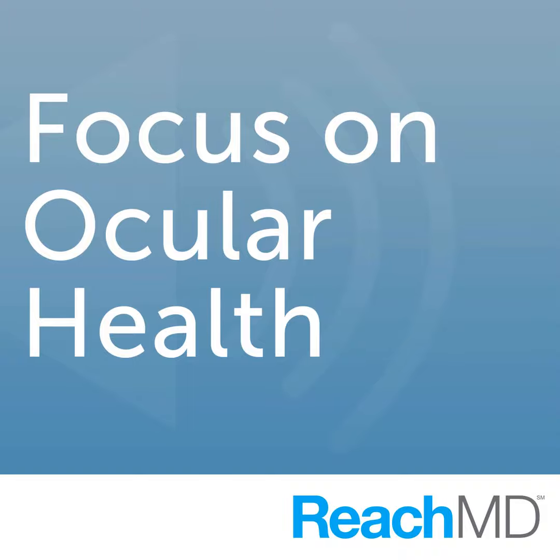It's non-invasive in the sense that we don't have to inject any kind of dye. It's very similar to ultrasound in that it's basically a reflection. Instead of reflecting sound, it's reflecting light waves. And the kinds of things that we can see are traction on the retina, which produces swelling. We can see the earliest signs of diabetic eye disease, the earliest signs of macular degeneration, and several other more exotic forms of retinal pathology, as well as being able to examine vascular occlusive disease.